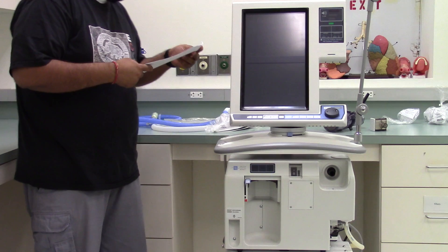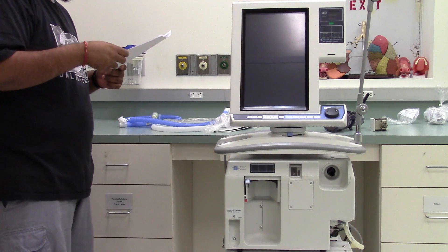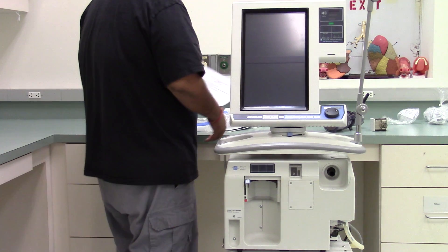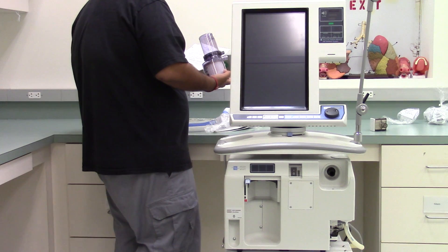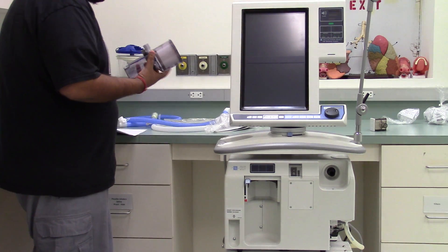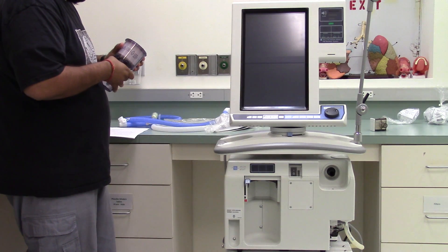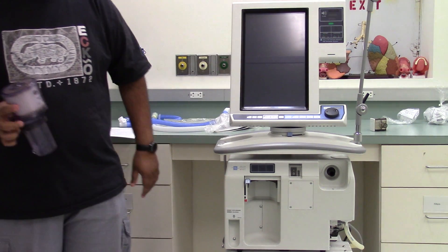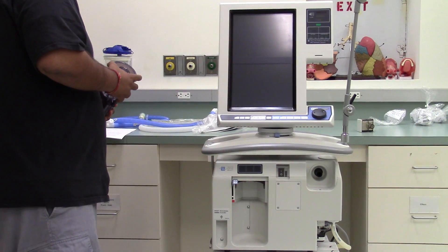The PB 840 ventilator can be used on neonates, pediatrics, and adult patients. When using the ventilator on neonates and small pediatrics, a different circuit is used. The PB 840 is electrically powered, although an internal battery can run the ventilator for a short period of time. There is an internal oxygen analyzer that measures the actual fraction of inspired O2. The PB 840 requires 50 psi air and 50 psi O2 to power the gas flow.